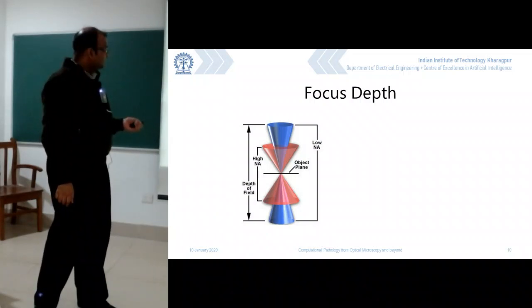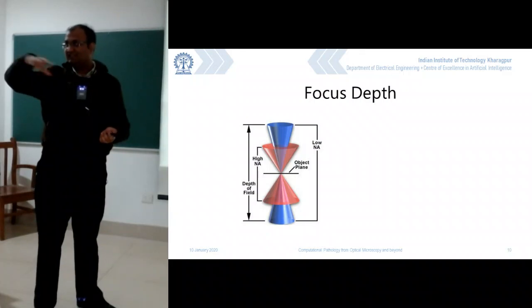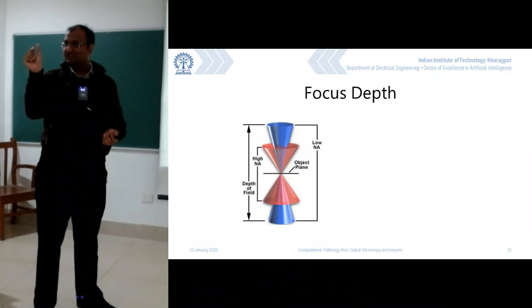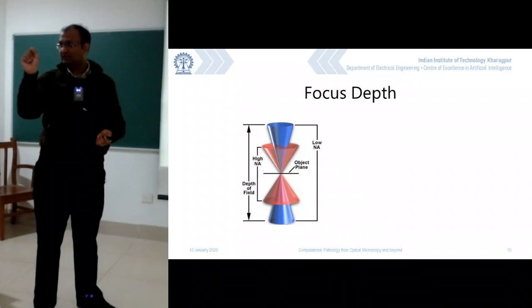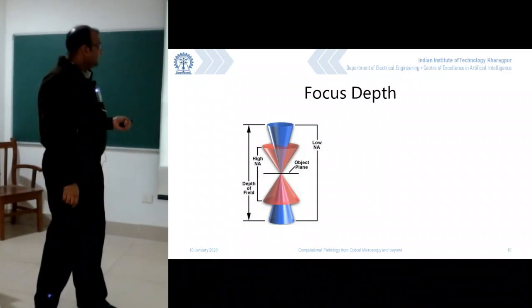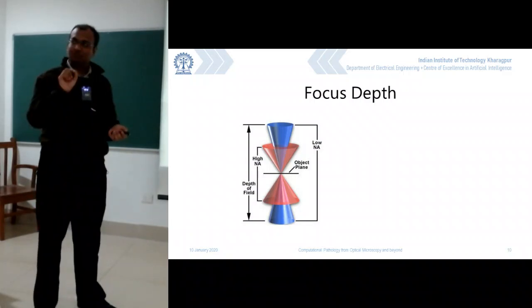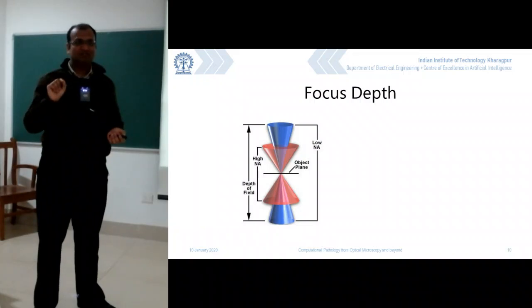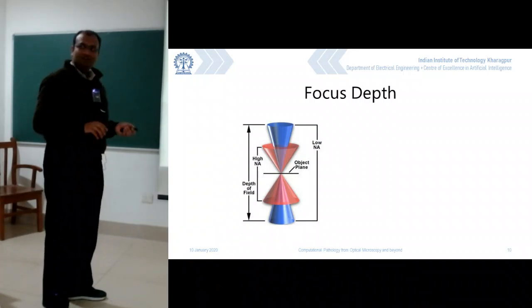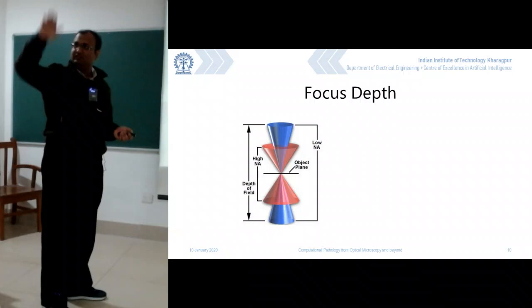But the point is, when you look at a digital sensor placed over there, a digital sensor has a fixed size. So it will have some 10 microns cross 10 microns. Now if 10 microns is from here to here, then whether the light is incident over here versus here, everything is going to cast itself as one single pixel. What that would mean is, if I keep on moving my sensor from here to here and back, my image is still going to be in focus.